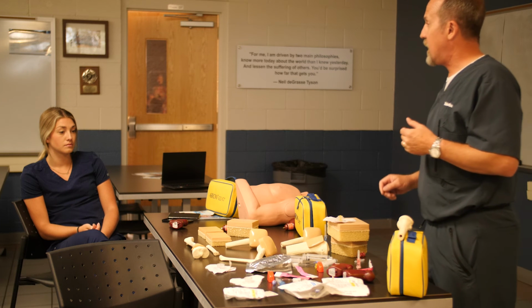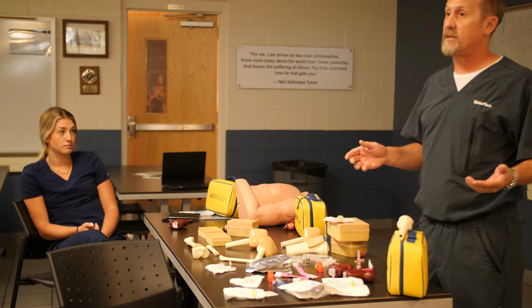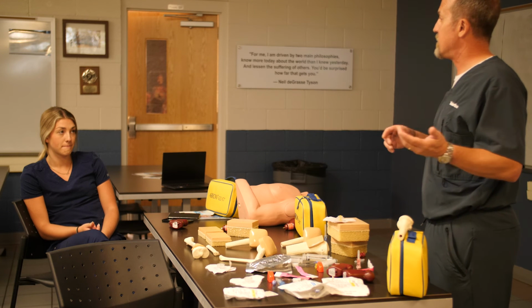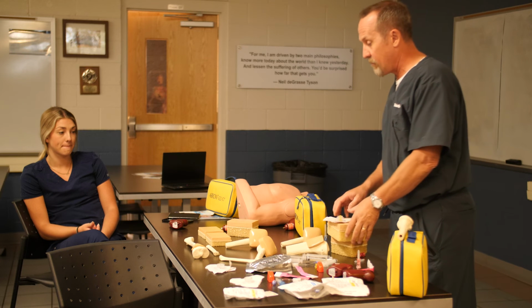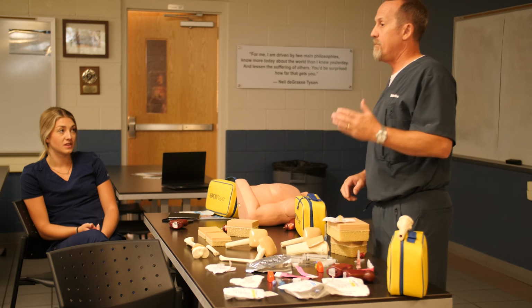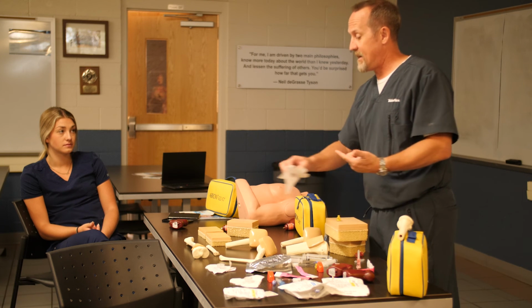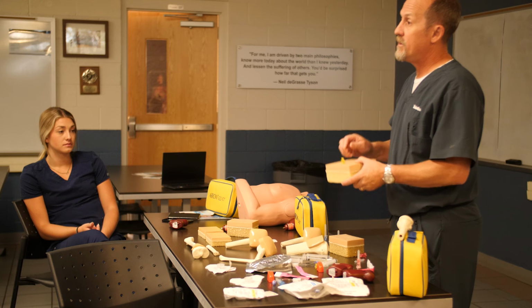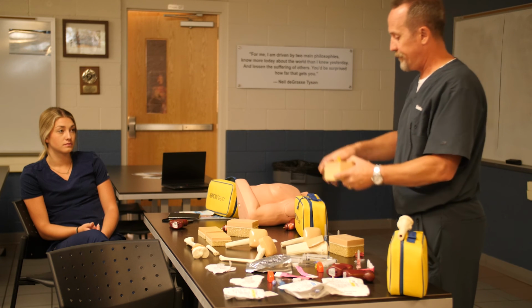So the last thing I want to cover, and you probably don't very frequently have to remove this device, right? You pass them off typically, okay? If there's ever a situation where you have to remove the device from a patient, the most important thing to remember is we're going to take the extension set and the dressing off. Most important thing to remember is that we do not ever want to rock back and forth with the hub.